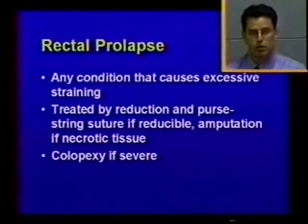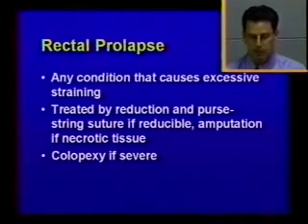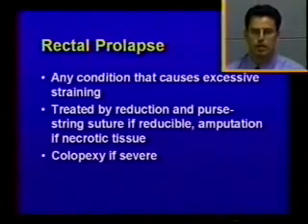Rectal prolapse can result from any condition that causes excessive straining. We usually attempt to treat this by manually reducing the prolapsed section of rectum and tying a purse string to hold it in, and then trying to correct the underlying problem that's causing straining. If we have non-viable tissue that cannot be reduced safely, then we will have to amputate the section of rectum that has prolapsed and perform a 360-degree anastomosis. If the condition is very severe, we will sometimes also do a colopexy to help prevent recurrence. So I have to do an abdominal incision and go in and pexy the colon to the abdominal wall.